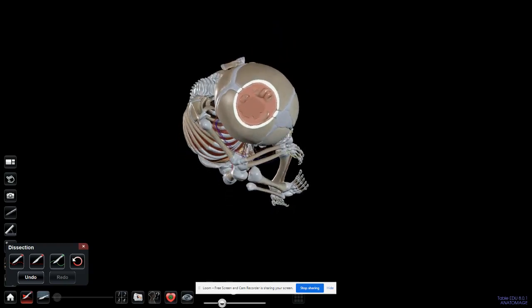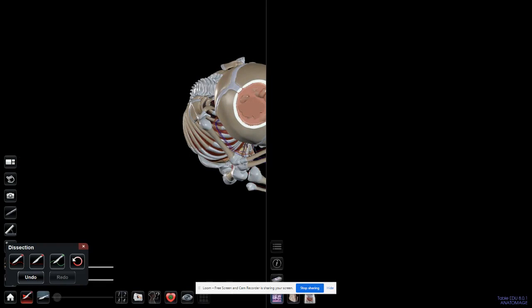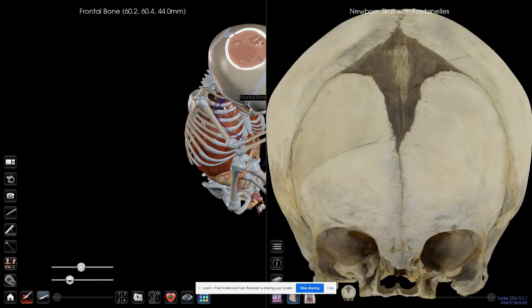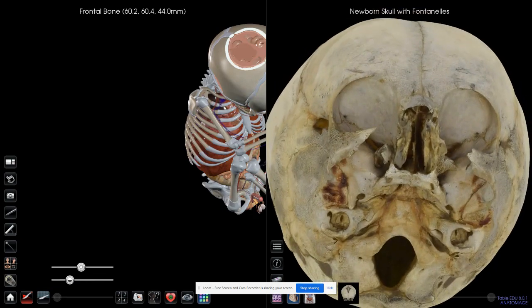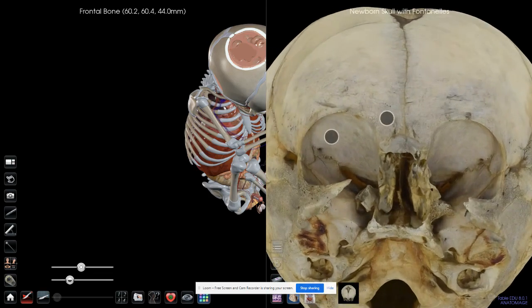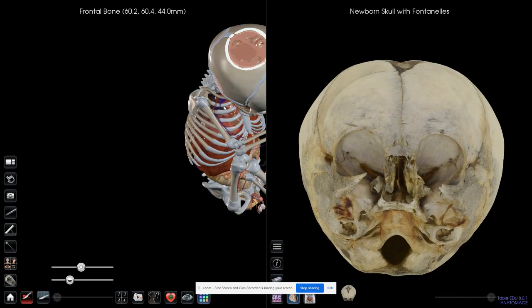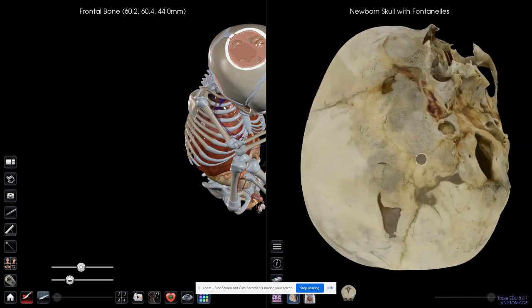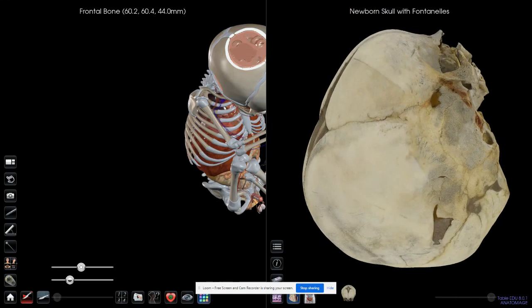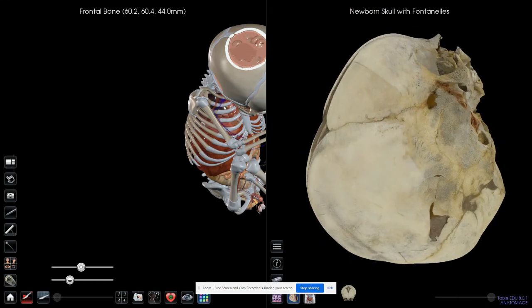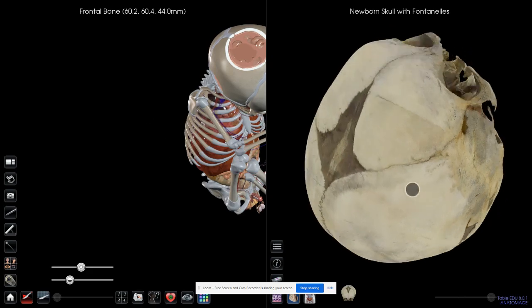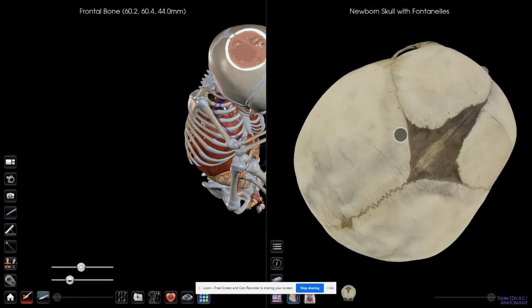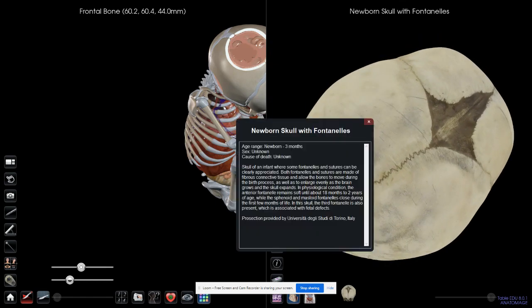If I want to see through it, this is the sagittal suture still remaining. Now I can see up again from the layout. From the square and the two squares next to it, I can add the histology by clicking on one of the organs there. It needs a little bit of time, so you have to be patient—the newborn skull fontanels. You can zoom in, zoom out, but you cannot dissect on this part, on the right part of the screen. You can do whatever you want here, but here it's just an image that you can interact with by zooming in and out, rotating, but not more, and reading about it also.